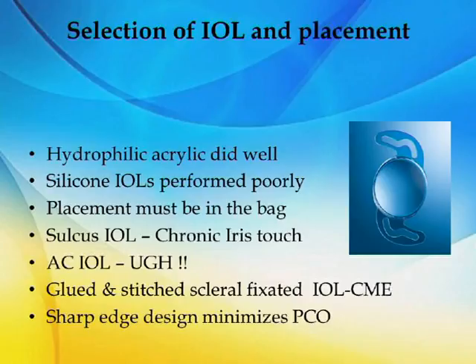The acrylic lenses were the preferred choice. In his study, both the hydrophilic and hydrophobic lenses scored equally. But the latest studies, conducted in 2012 and 13, feel hydrophilic lenses with sharp edges are far better in such situations, and you can expect less formation of PCO.